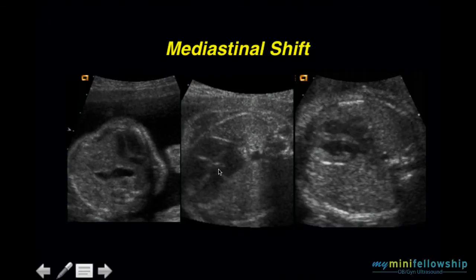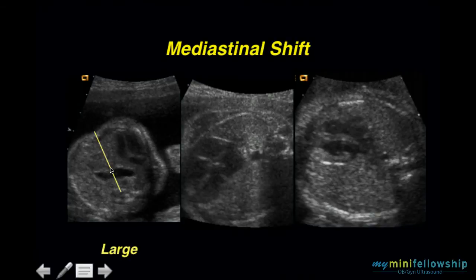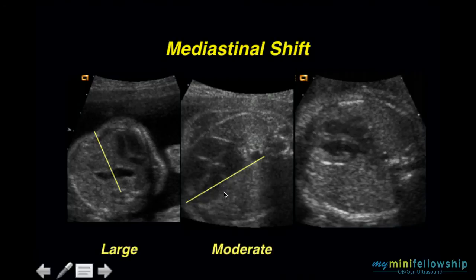Here we have three examples. In the first, we draw our mid-sagittal line and can see a large mediastinal shift — the heart does not even contact the mid-sagittal line. In the second, we draw our mid-sagittal line and see that only the tip of the left ventricle is in the left hemithorax. The entirety of the right ventricle, right atrium, most of the left ventricle, and nearly all of the left atrium are in the right hemithorax — a moderate mediastinal shift.